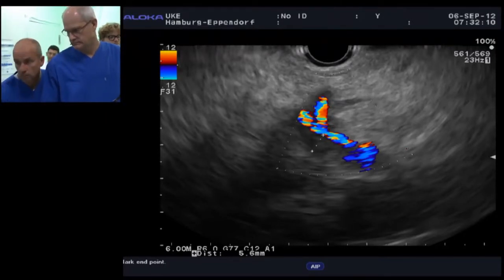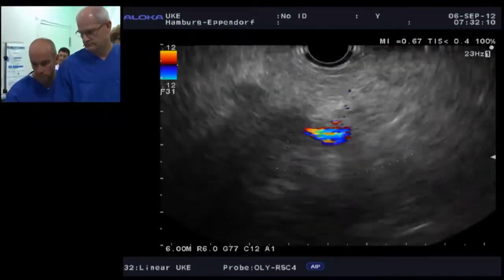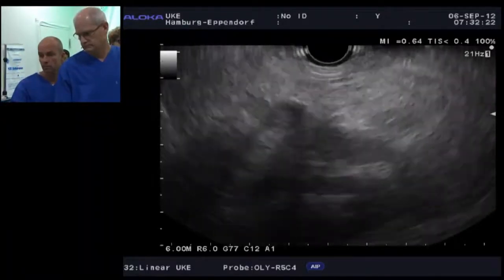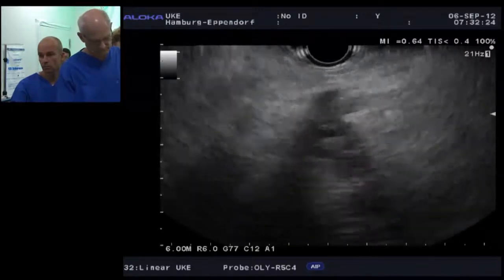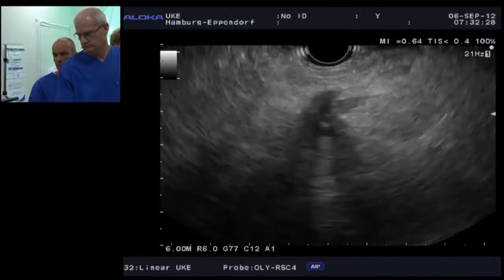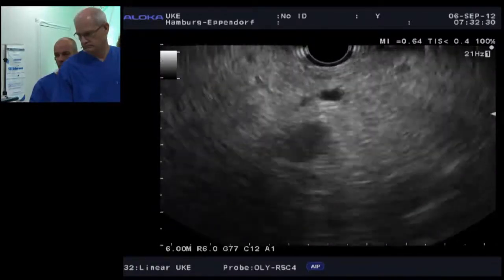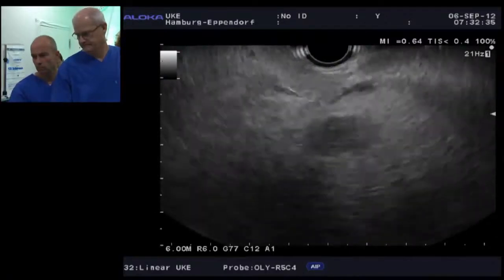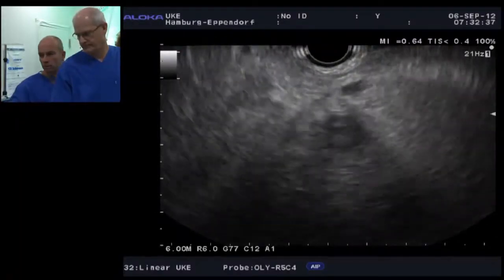I think this is tumor. We've seen this pattern before, and the pattern here is, again, a small tumor. It's a very subtle one, and I think you showed it nicely, probably in the inferior part of the pancreatic head when you were imaging from the bulb. But I think this tumor has escaped the pancreas and is likely tracking along the vascular sheath of the celiac artery and the splenic bifurcation.